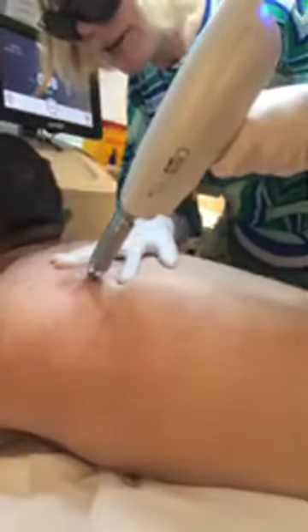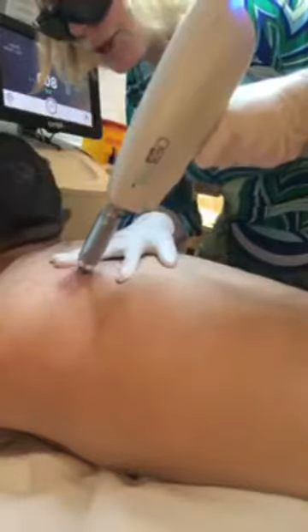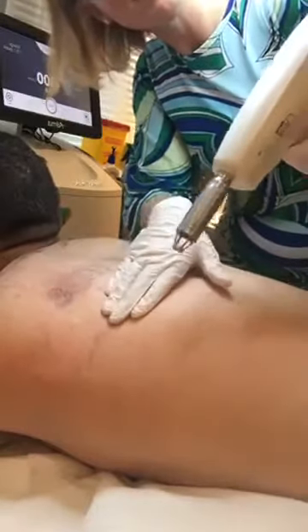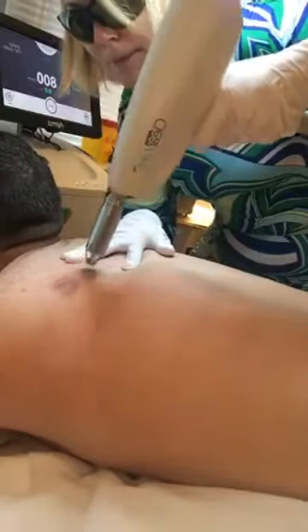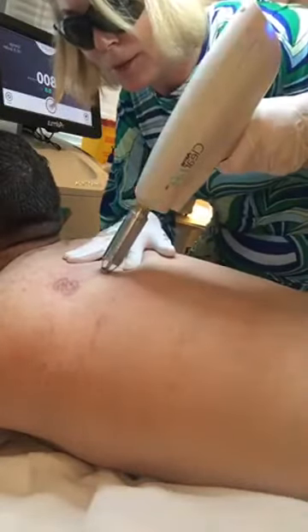Generally speaking, with tattoo removal it is a series of treatments. It can be as few as three or four — that's best case scenario — or as many as ten. It really depends on a number of variables, particularly the color of the ink. Different color inks have different responses to laser. Black ink or navy ink tends to respond much better than some of the colored inks. Red ink can do fairly well too, but other inks are much harder. There's two letters done already — black, blue, and red are usually our easiest ones.